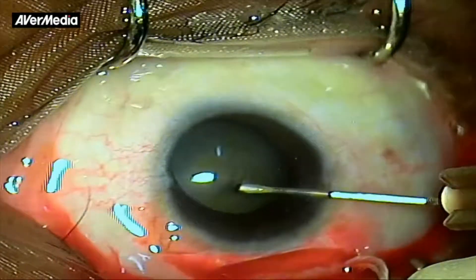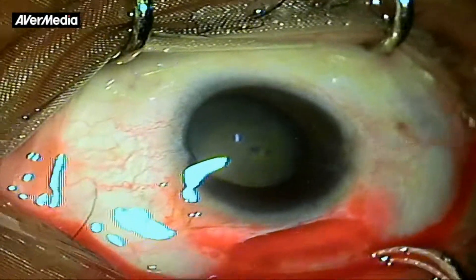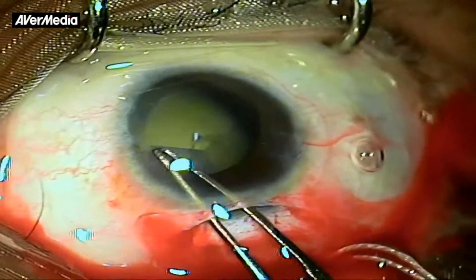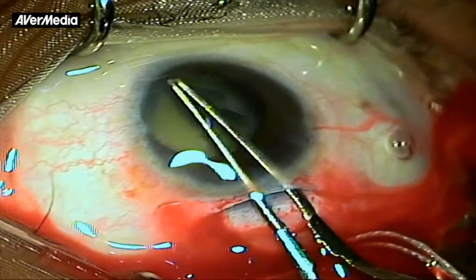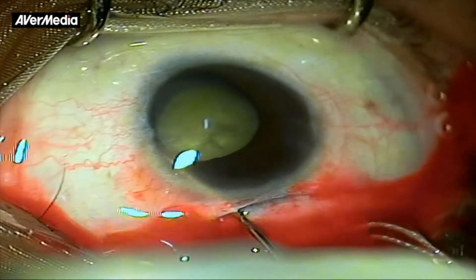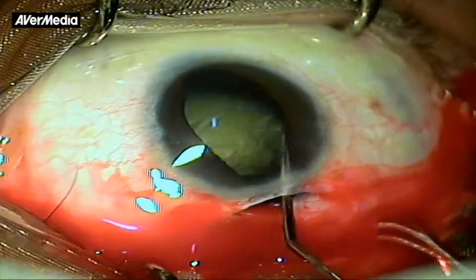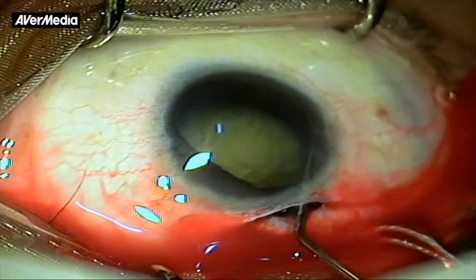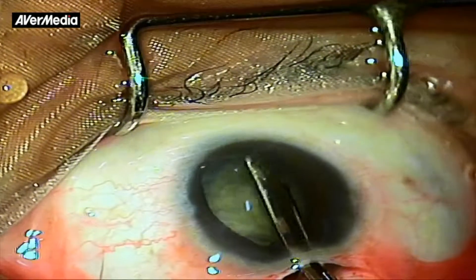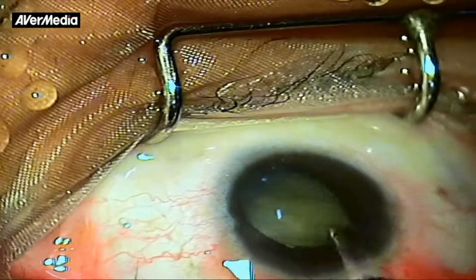There was microphacodonesis and a lax anterior capsule. A Utrata forceps provides the best tool in making a successful capsulorhexis in such a case. During hydrodissection, we realized that the nucleus was large and had plenty of epinucleus. There was no way to prolapse such a nucleus into the anterior chamber simply by hydrodissection.